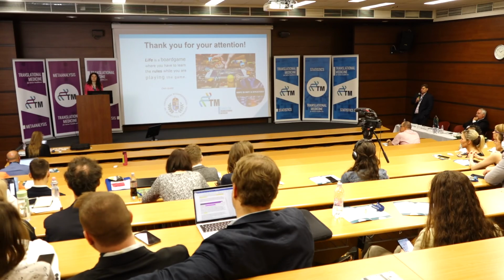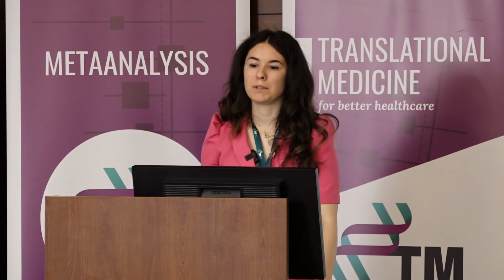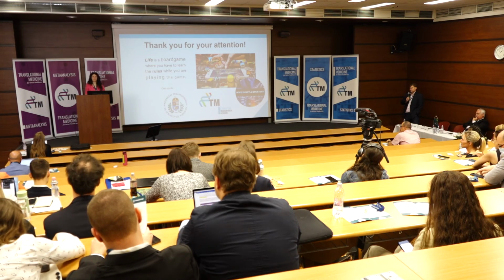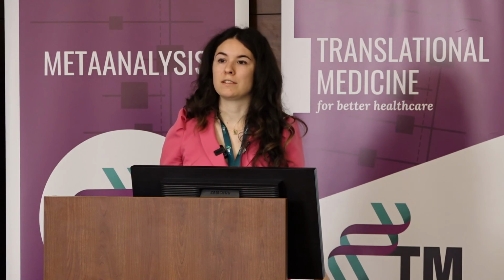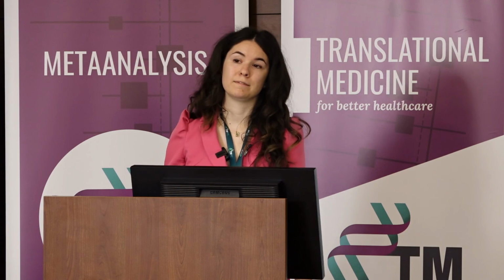Yes, thank you for your question. Mostly the articles use models and not patients, and this is a limitation because we usually use these scanners not extraorally but intraorally, where we have saliva and many other factors that can also influence the accuracy, and this can also cause bias because maybe it is very easy to handle a model in my hand, and it is easy to scan it, but in real life, when the patient has blood and saliva inside the oral cavity, it is very hard to scan the teeth as well.